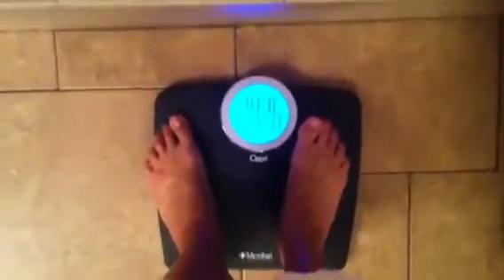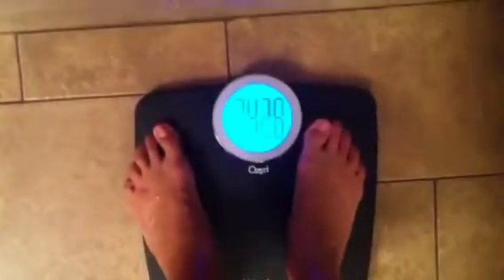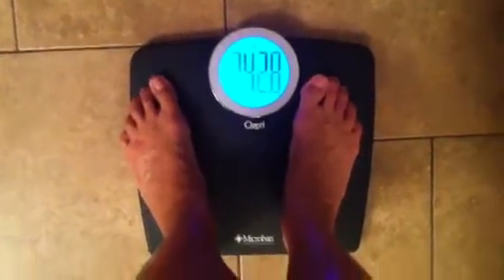It lights up when you step on it, so you can use it in the dark. 242.8 — it means I gained a little weight because my doctor put me back on my steroids.